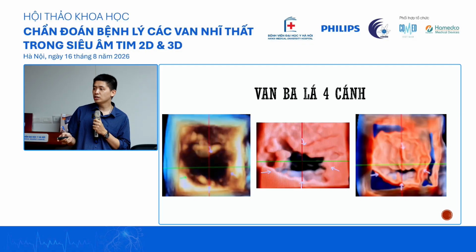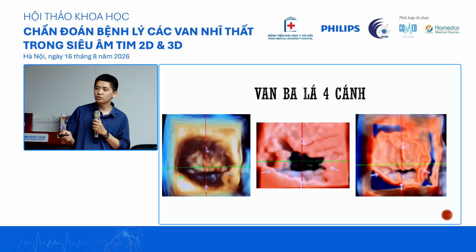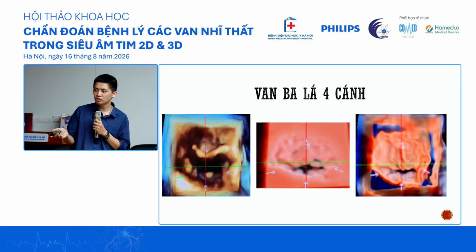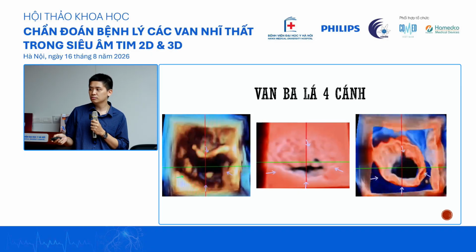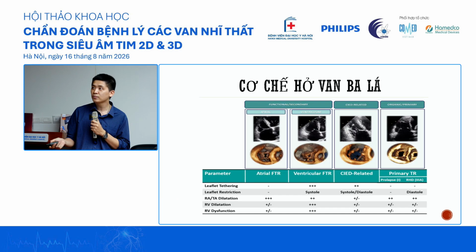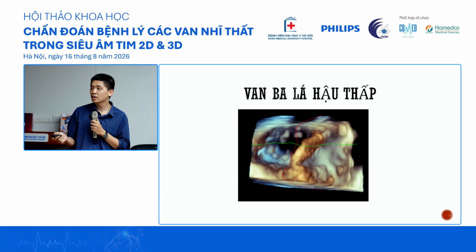So this one is a patient with a quadricuspid valve. You can see 1, 2, 3, 4 here. So this makes identifying the anatomy on 2D even more difficult, because we have so many combinations of valve position and number of leaflets. Mechanism-wise, you also look at this on 3D.